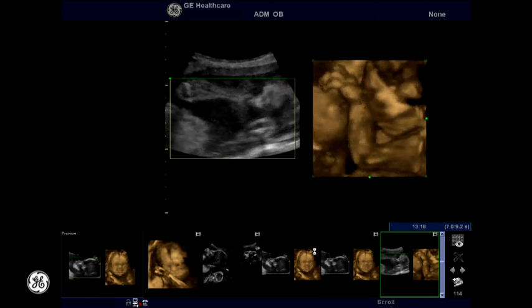fetus is active. This concludes our LOGIQ F series 3D4D instructional video.